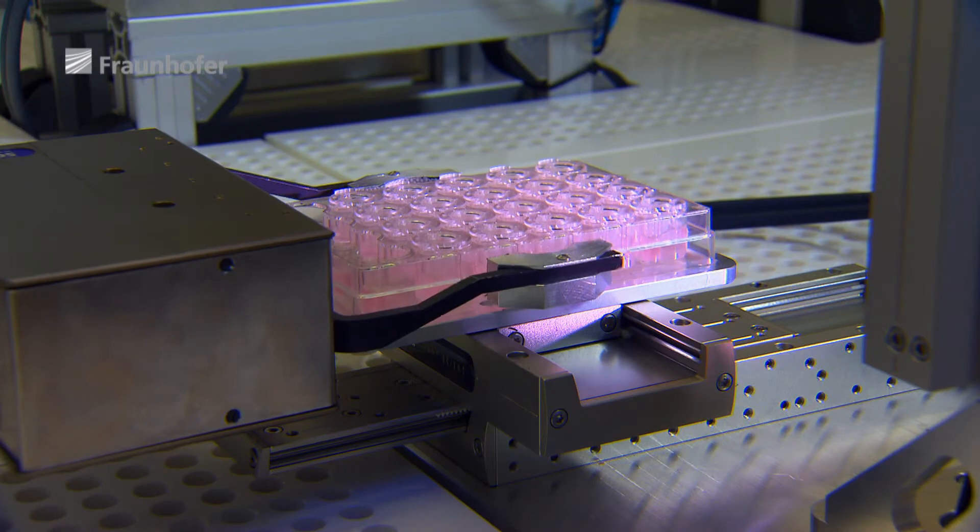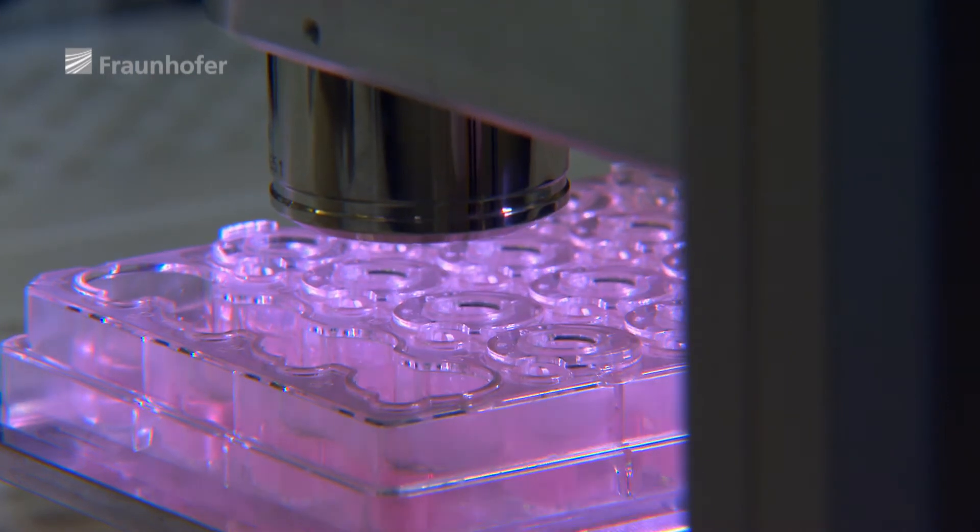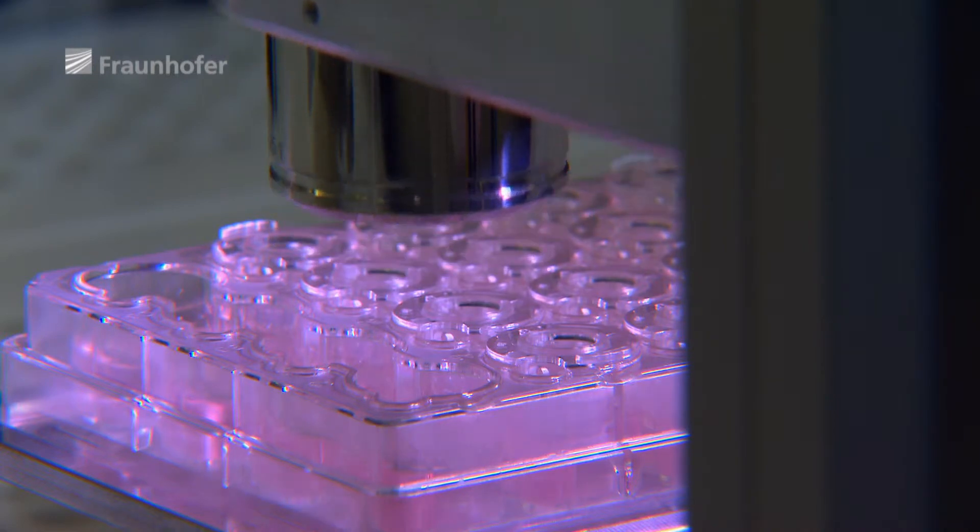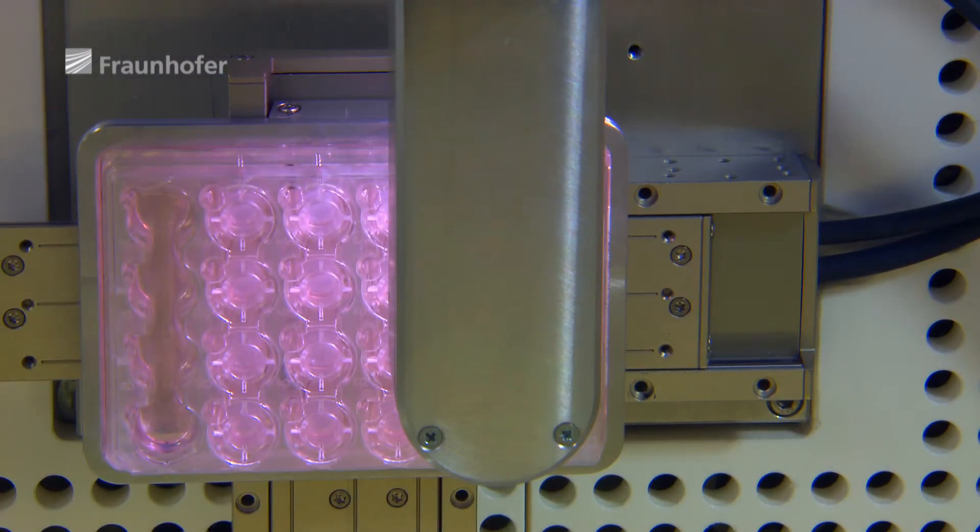At the end, each of the 24 virtually transparent pieces of skin in the dishes has undergone a fully automatic quality control process. Even when it was just a prototype, the system met all the hygienic standards of good manufacturing practices.